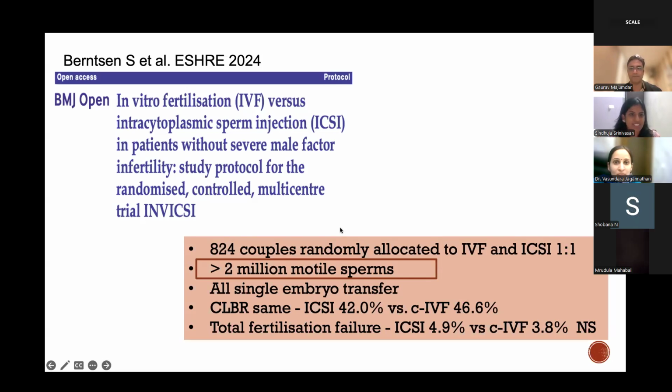So these are basic questions I just want to ask. We do large volume well inseminations, in the 4 well dishes. Actually, we use 5 well dishes, and we add a large volume of media and we do group culture. So in each well, we have 6 to 8 OCCs. Okay. Okay. Yeah.